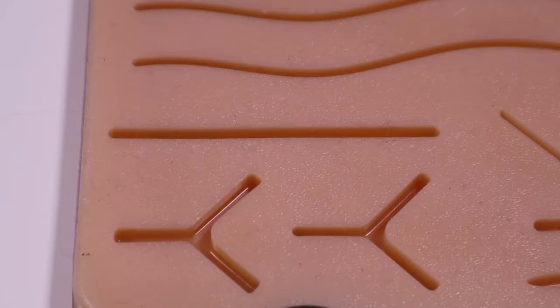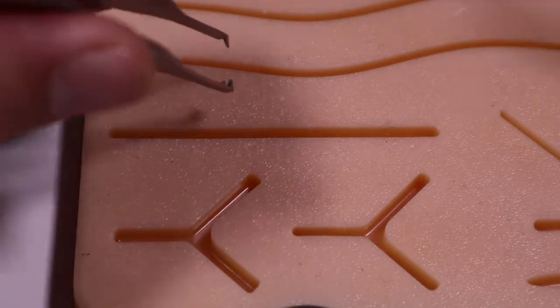All right folks, today we're going to be working on the vertical mattress suture technique. This is the far-far, near-near method that is really good for deeper wounds and wounds that you really want to get good everted edges for. That's always better for aesthetic results, so let's go ahead and get started.